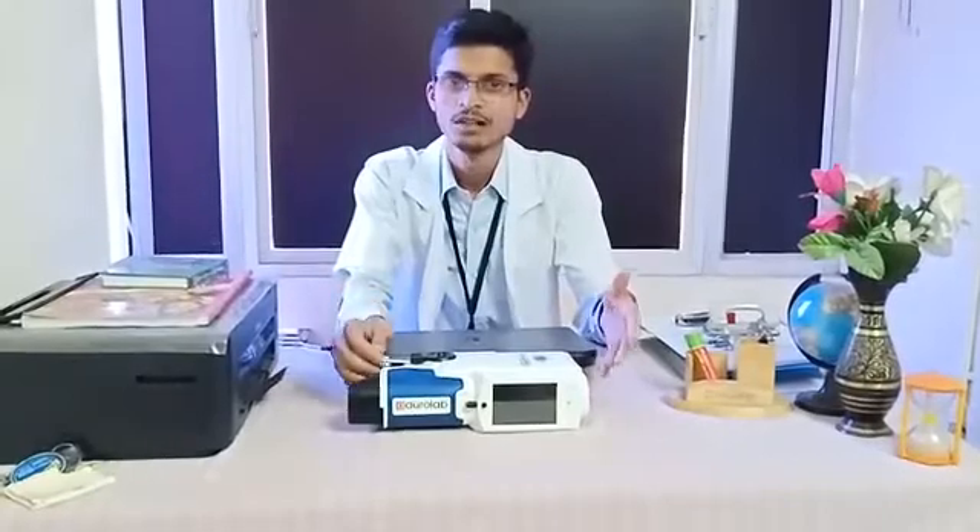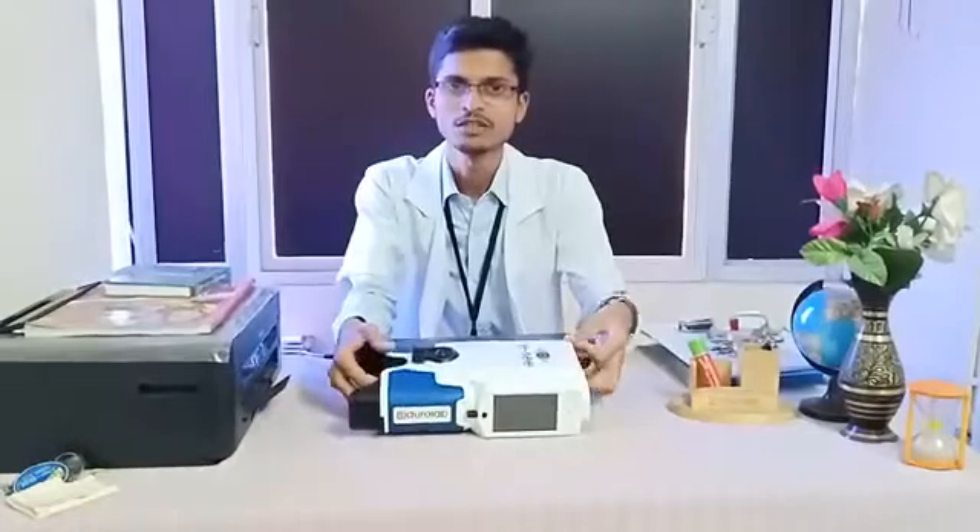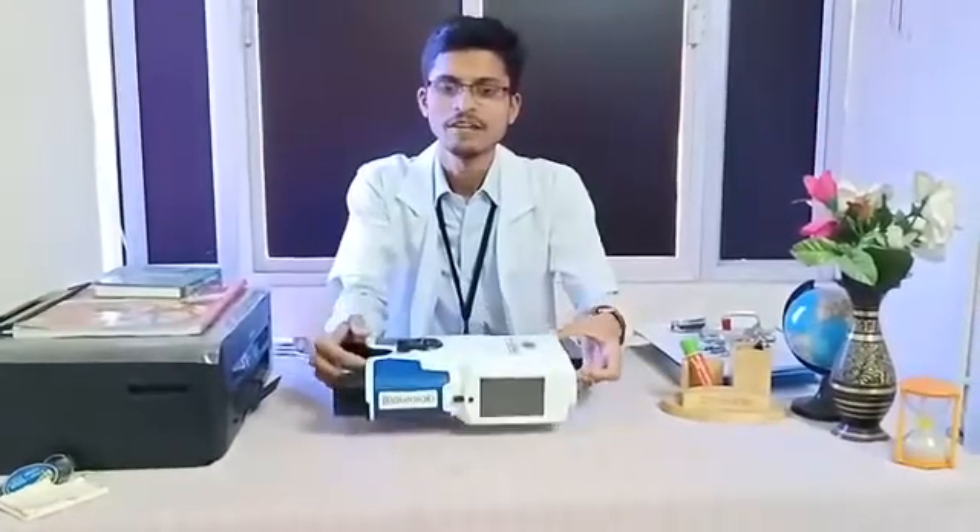In places where we have experienced flooding — we went to Tanjur and Thiruwarur — when people were affected by floods, this instrument was highly useful in those times.